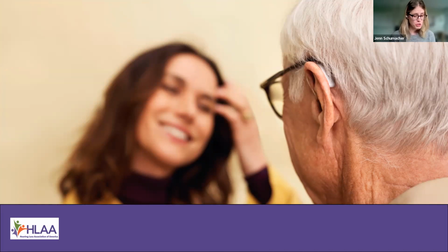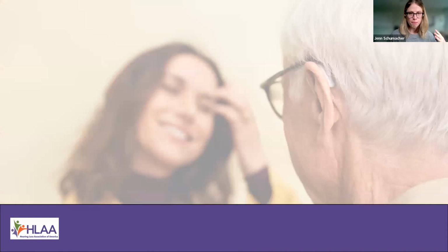Sometimes with hearing aids, especially when you're a new user, you put them on and it feels like everything is just louder. But hearing aids are actually more sophisticated than that, and they are using specific pieces of technology to specifically help you hear speech better amongst a lot of background noise.